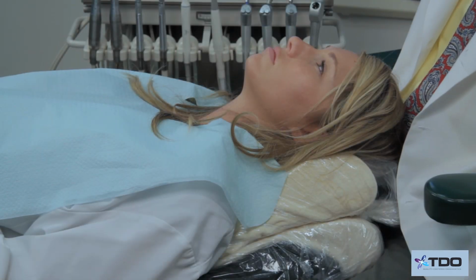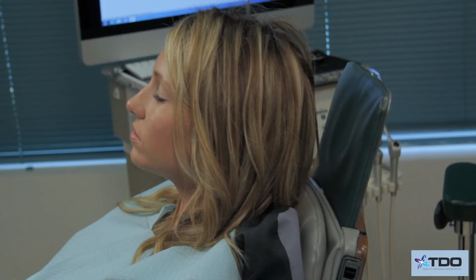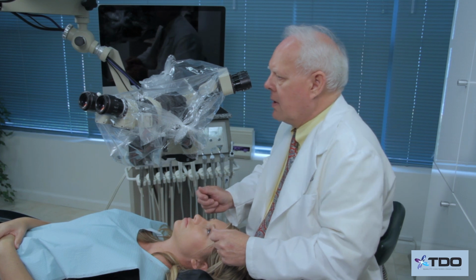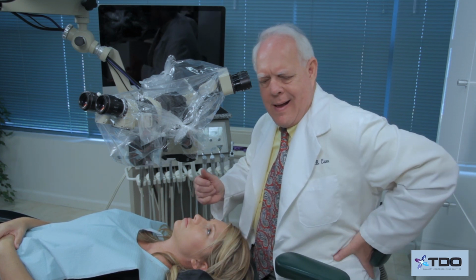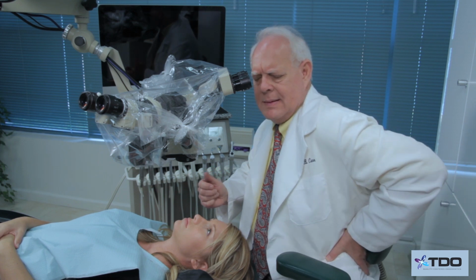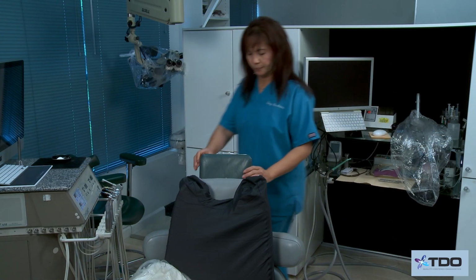To operate efficiently under the scope, the patient's head must be essentially in your lap. If the doctor is too far away because of a protruding headrest, then the doctor will have to bend forward from the waist, as seen here, introducing a destructive Class 5 motion on every single patient. Therefore, on most dental chairs, the headrest will need to be removed.